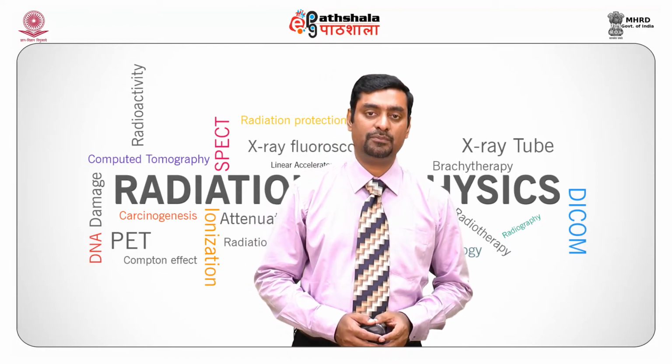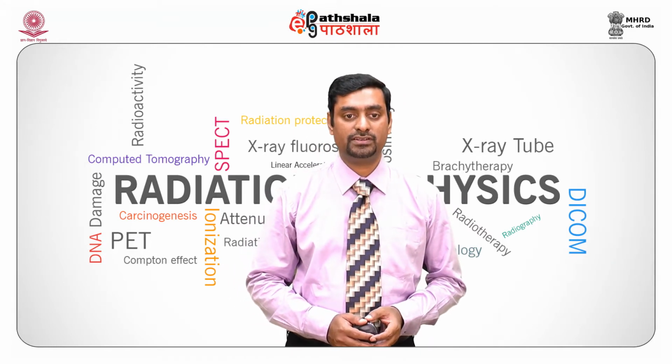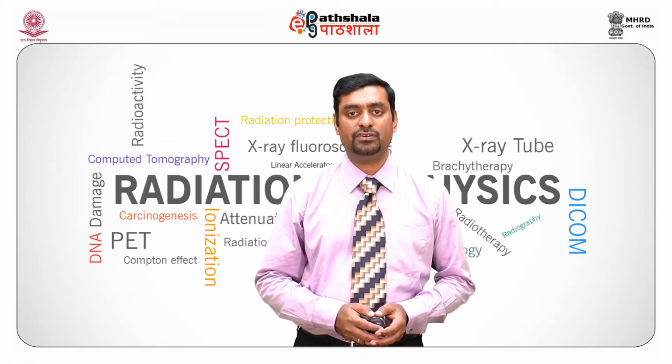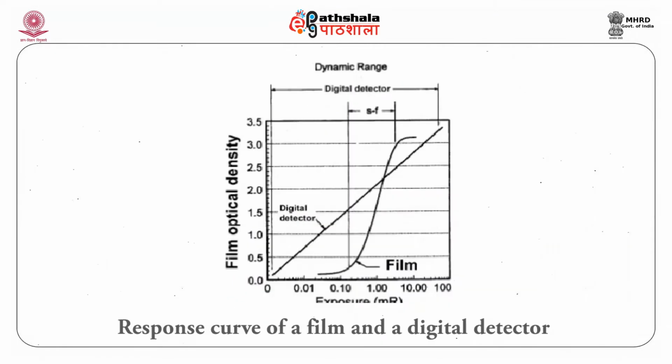Increased efficiency and patient flow are possible with digital mammography detectors. It also enhances image quality, and there are a lot of options available in digital mammography which are not available in a film screen combination. In this image, we see the response curve of a film and a digital detector. We see the film's characteristic curve as well as the wider latitude in a digital radiography system. The exposure and optical density are independent in a digital detector.